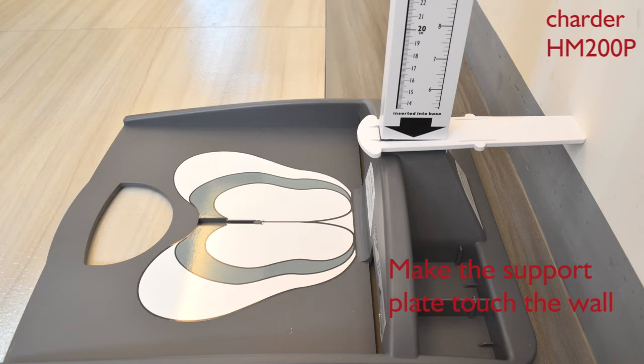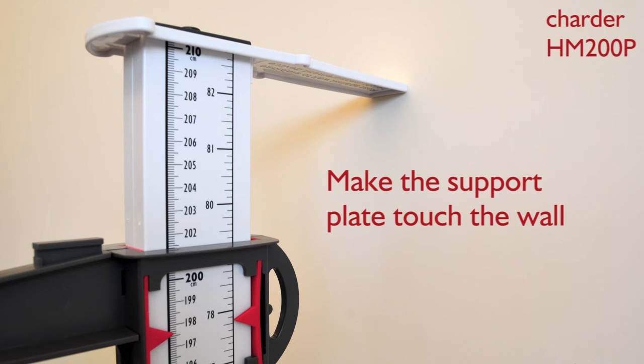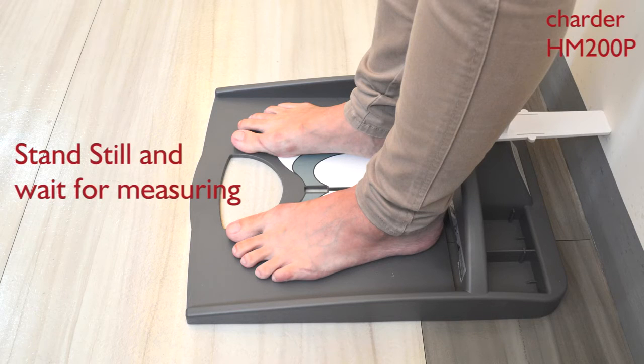Make the bottom and upper support plates touch the wall. Keep the patient ready and waiting for height measurement.